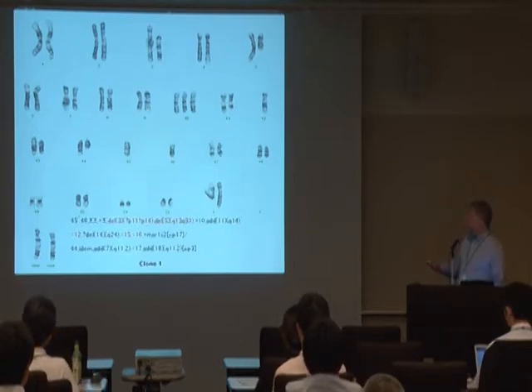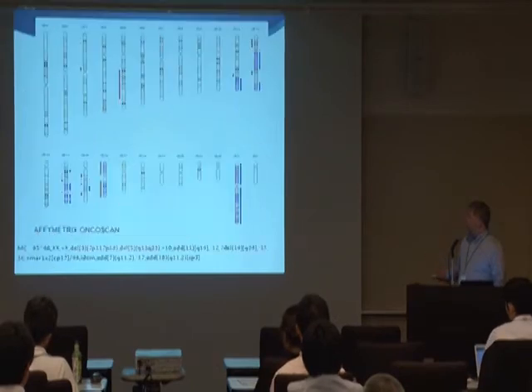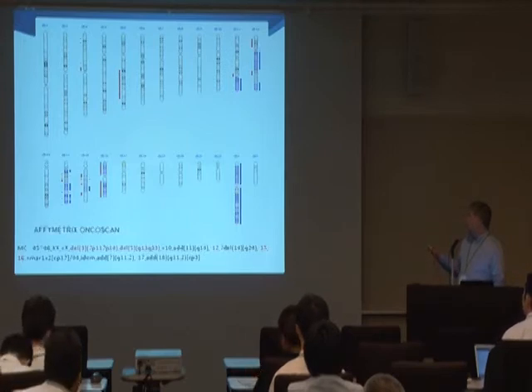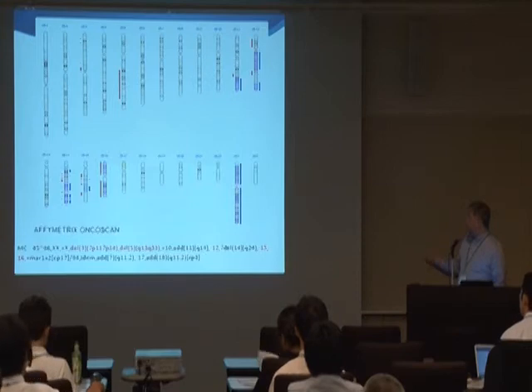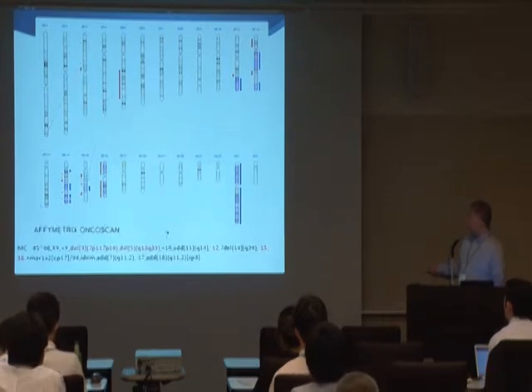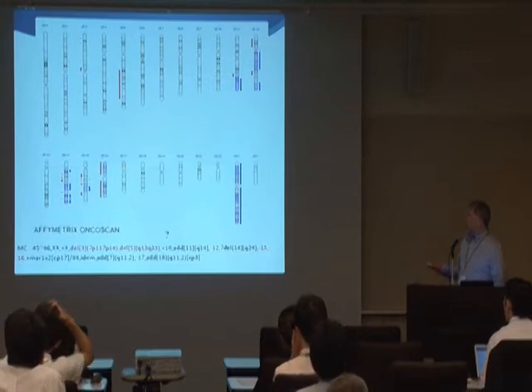And so there's a lot of things going on, and when we looked more closely using the OncoScan again, we saw what we expected to see here with the deletion on 3, 5q. And let's not forget the additional chromosome X. And then if we look at these abnormalities, we didn't see the plus 10 on the array, but it was only in a few cells from the metaphase cytogenetics.